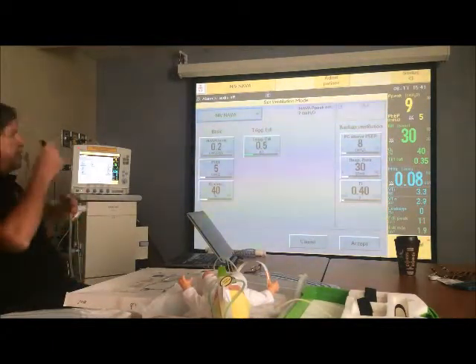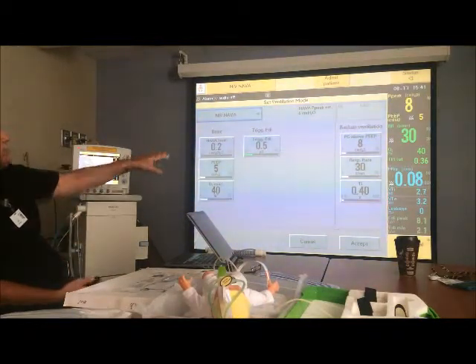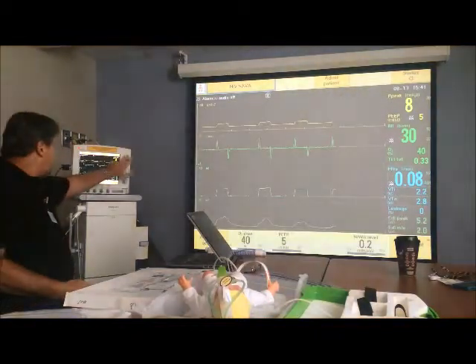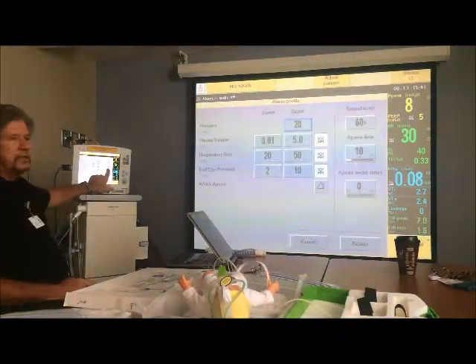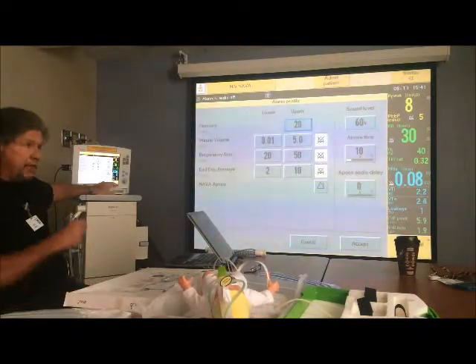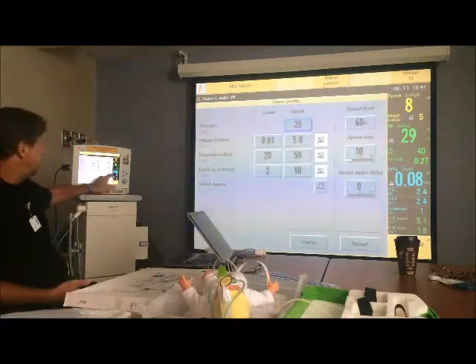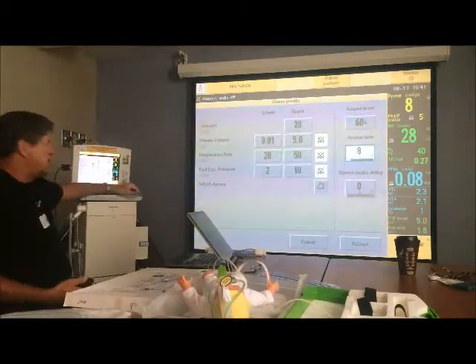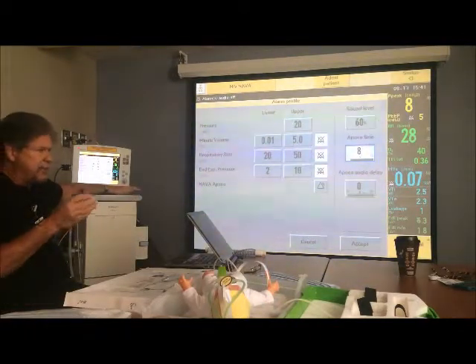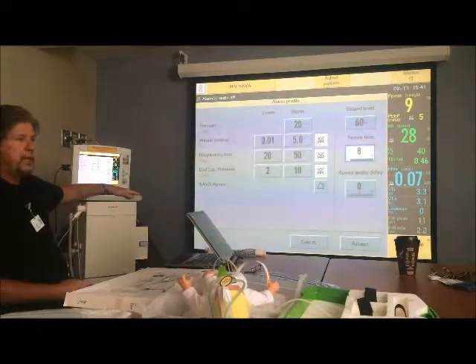Now, the lesson here, or what you have to do, is say, all right, I had my apnea delay set at 10 seconds, but I noticed that he had some desaturation before it went to backup. So what would you do? Decrease this to 8, right? So now it goes to backup at 8 seconds, and you go, did he have any desat or bradycardia? No, he was good. Okay, that's the point at which you want to be.